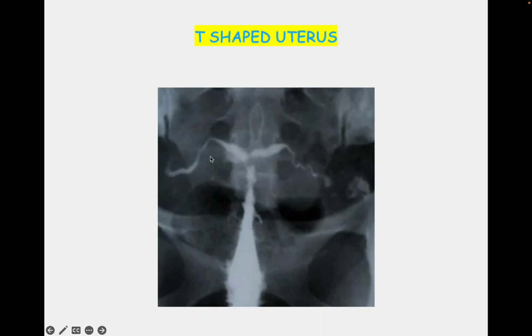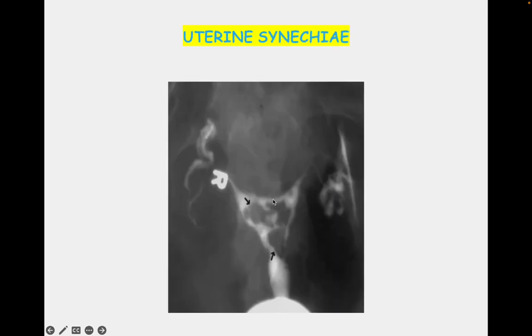This is a very classic picture: the T-shaped uterus. This is the classic picture of a patient suffering from female genital tuberculosis when the uterus is involved. Because of extreme constriction and scarring of the uterine cavity, it has a T-shaped appearance. The second picture shows uterine synechiae — you can see the dye pocketing, which represents uterine synechiae easily visible on HSG.